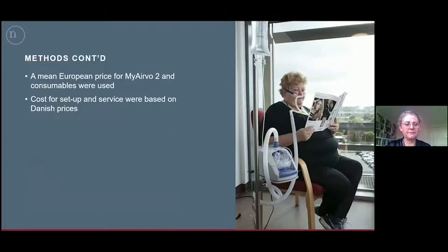The prices used in this study were for myAirvo 2 and consumables, a mean European price, and the cost for setup and service were based on Danish prices. The costs that I presented to you in the last slides were the cost of the service in the year that the data were gathered.